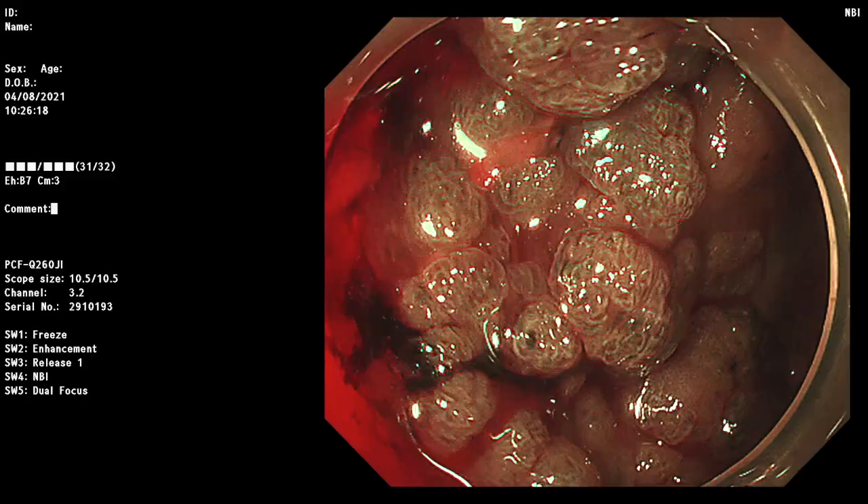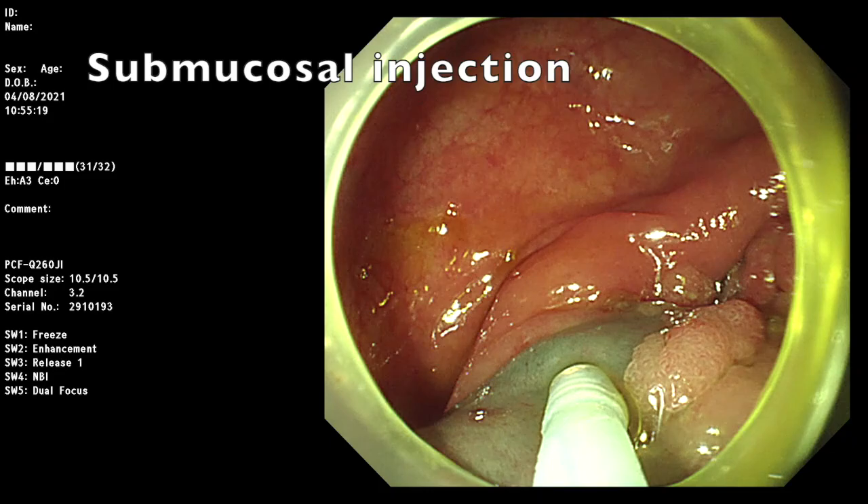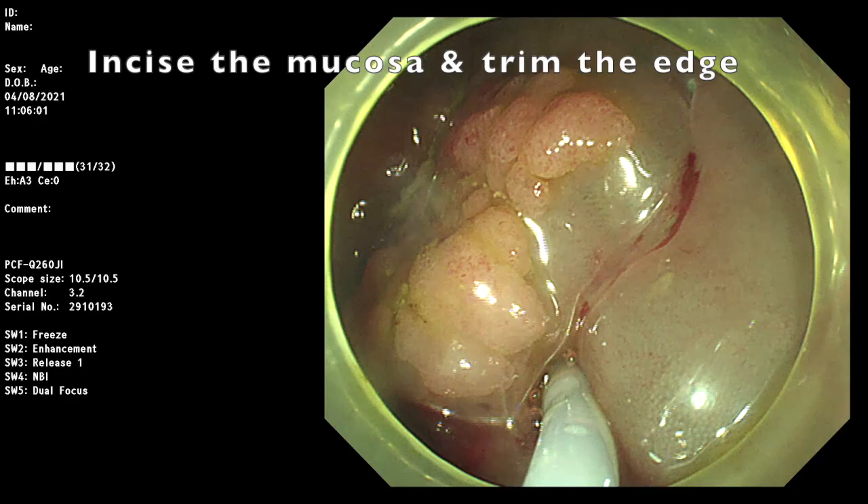First, we perform the submucosa injection around the tumor. Then, we use dual knife J to incise the mucosa and trim the edge.